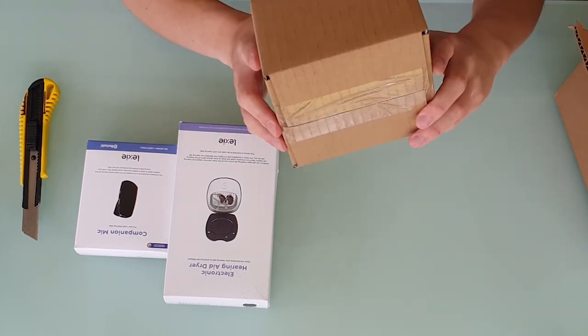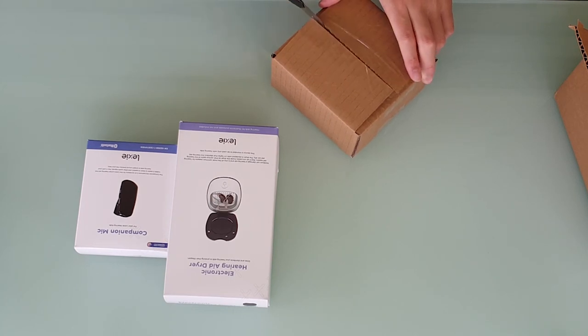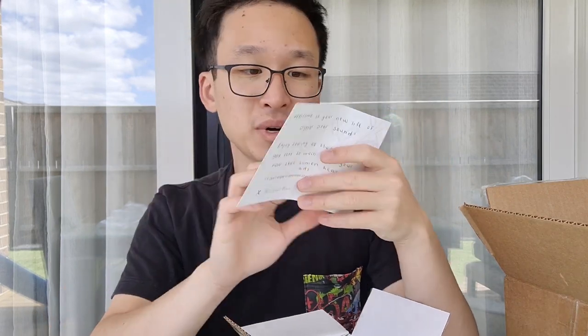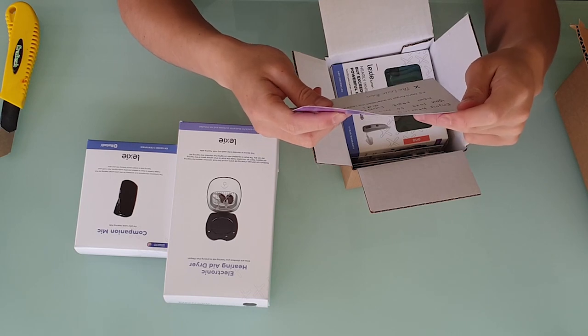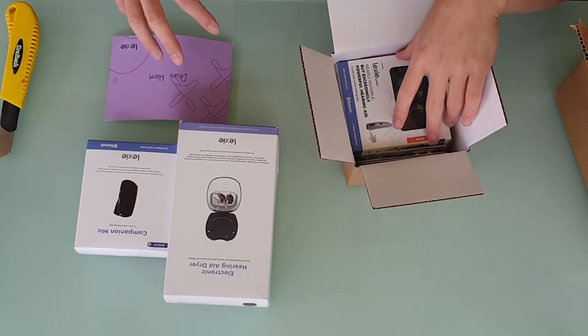And what I would assume is the hearing aids themselves. So if we pop this open quickly — let's see what they've got for us. The first thing I'm greeted by is a cute little note saying, 'Dear Mark, welcome to your new life of crystal clear sound. Enjoy hearing all the sounds you love so much with your new Lexi Lumen hearing aids. Don't forget to download the Lexi app. Lexi team.' I think that's super cool having a personalized handwritten note from the manufacturer. That is absolutely awesome.